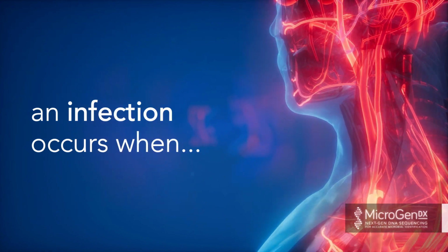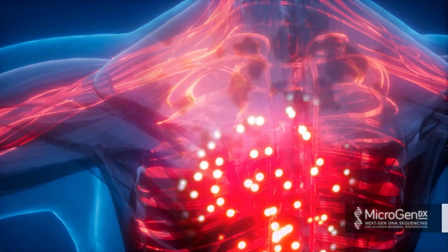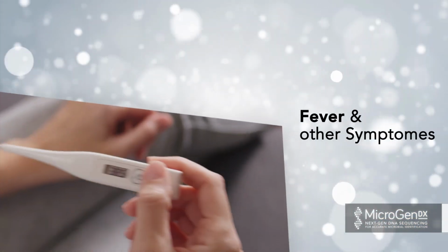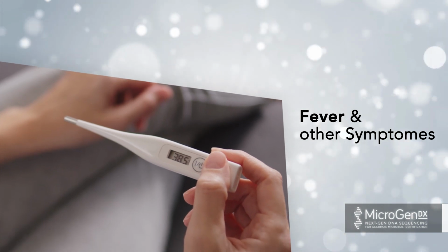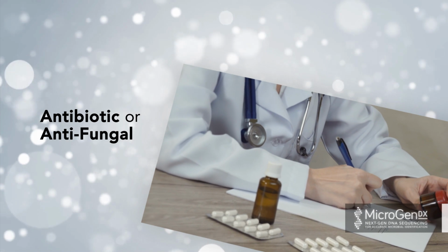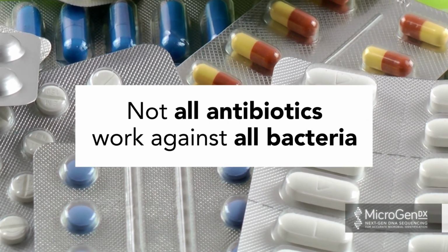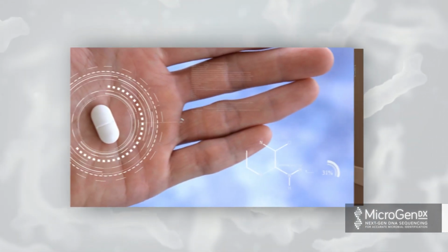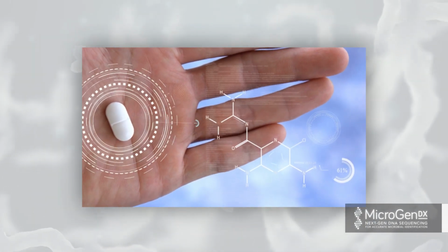An infection occurs when the host responds to these invaders, with white blood cells moving to the site and an inflammatory response. This means fever and other symptoms. Your doctor may need to prescribe an antibiotic or antifungal. However, not all antibiotics work against all bacteria. Your doctor will need to know the type of microbe or microbes causing the infection.